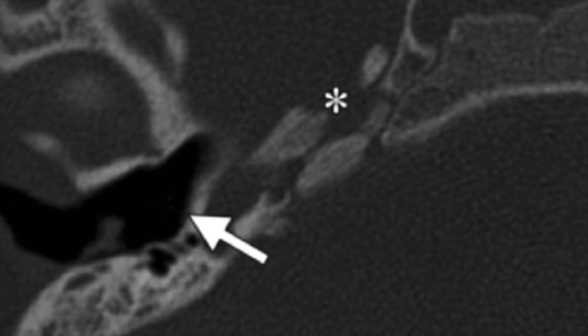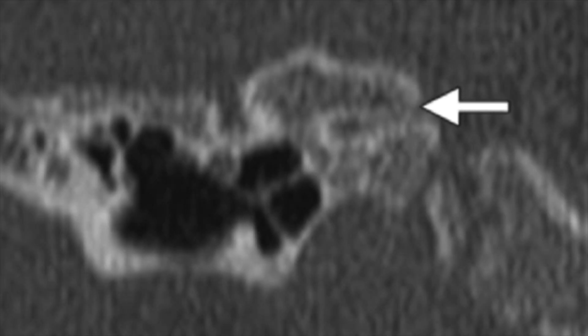In a separate case, here is an axial CT demonstrating the absence of inner ear structures. The arrow notes a flat medial wall of the middle ear cavity, and the asterisk notes the hypoplastic petrous bone. The arrow on this coronal CT shows an atretic internal auditory canal, abbreviated IAC.